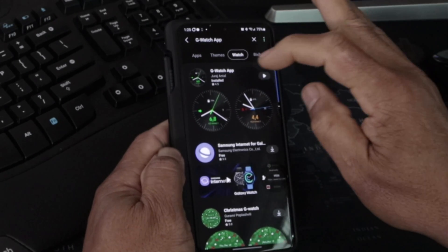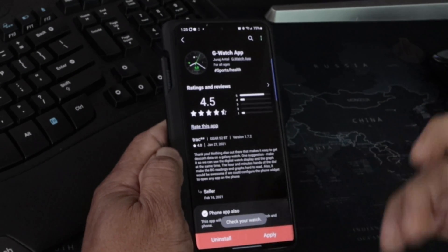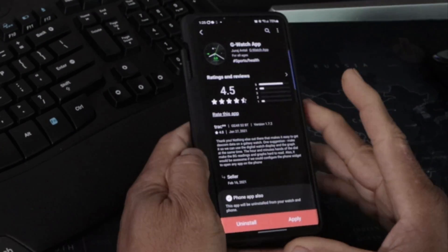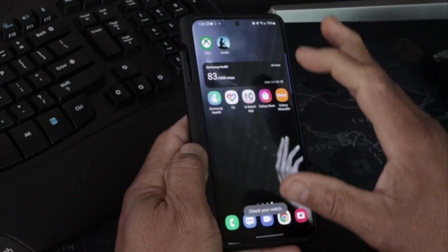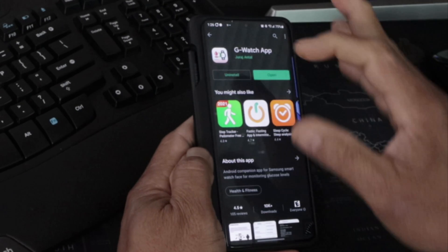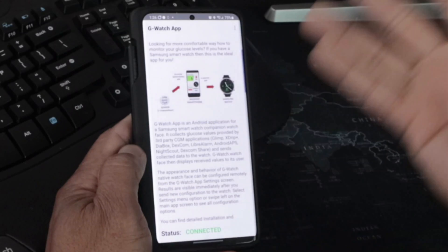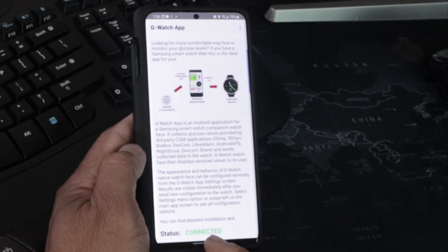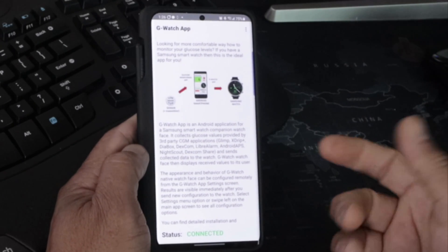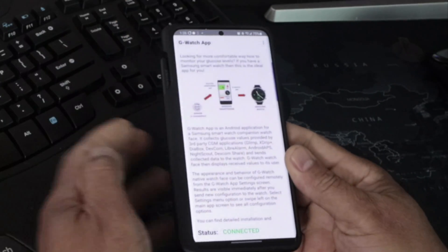Click download, apply it after it's downloaded, and let it do its thing — it should show up on your watch. Then close that, go to the Play Store, and download the G Watch app there as well. Open it up and it should say 'Connected' if your watch is paired correctly.